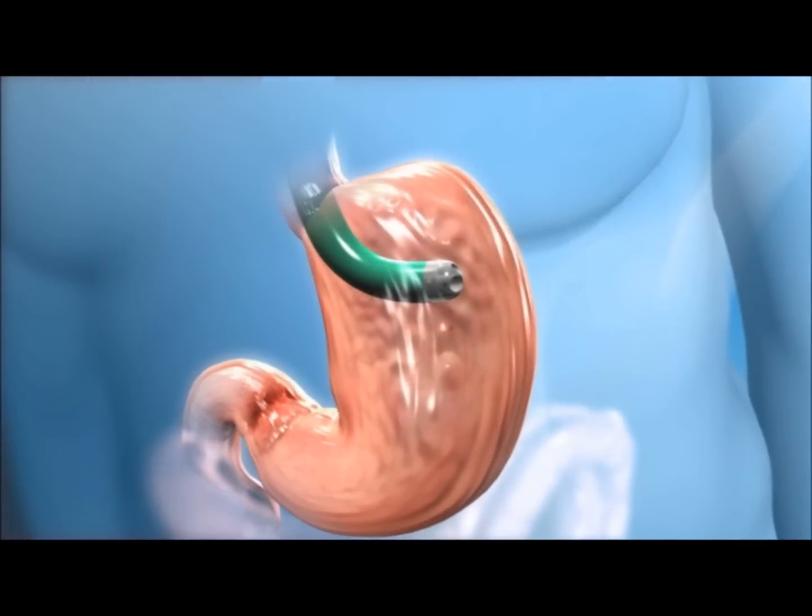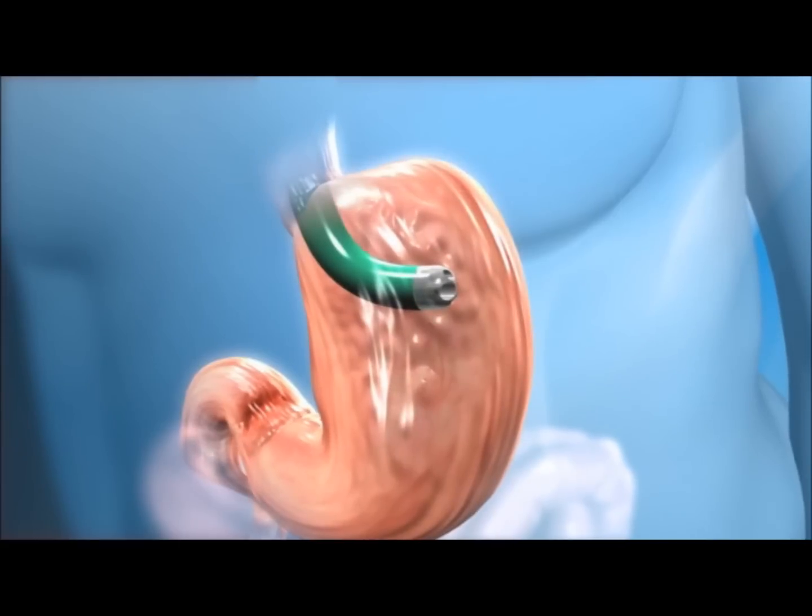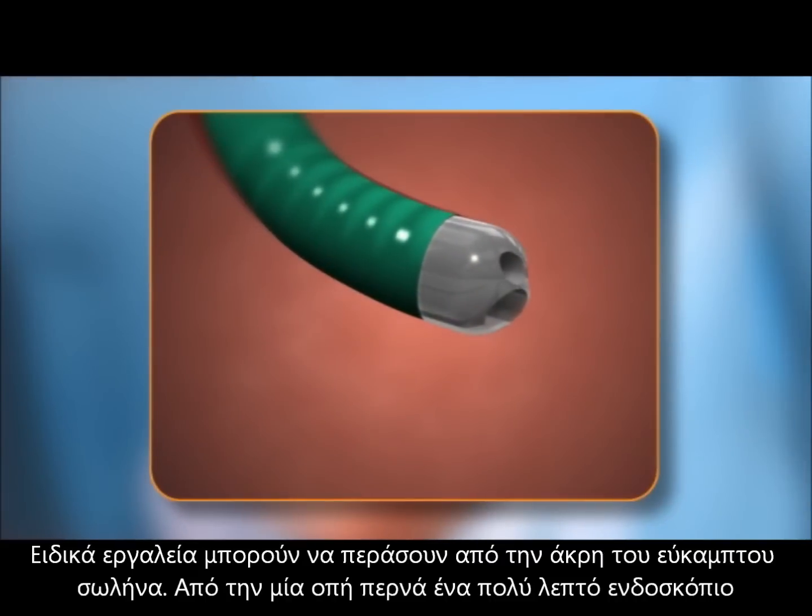Once in the stomach, the tip of the device can be turned and locked in place, providing a stable surgical platform.